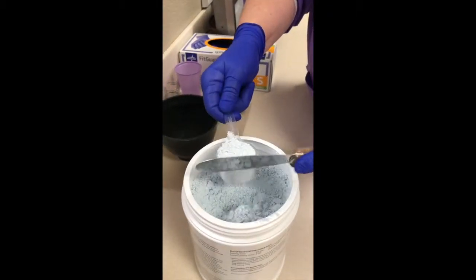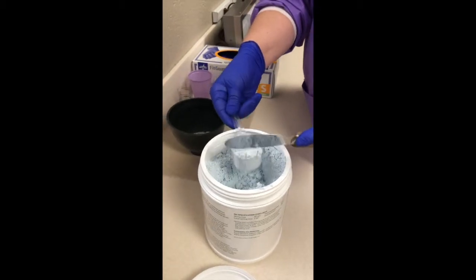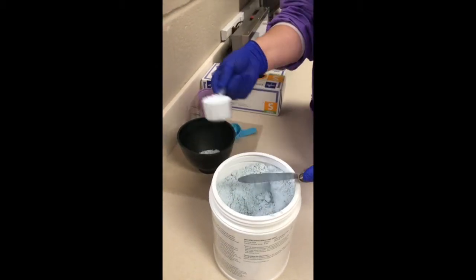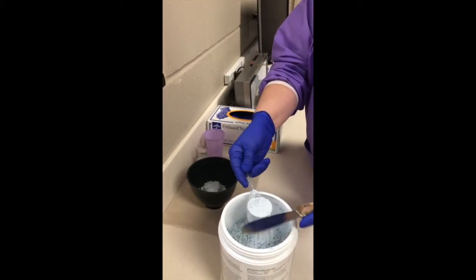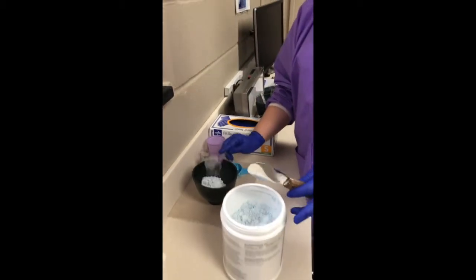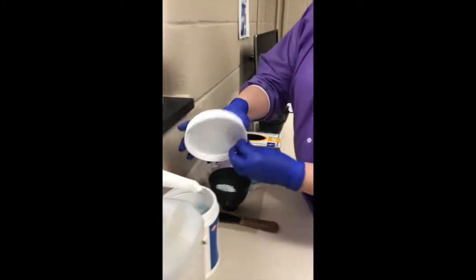Kind of just overfill and take off any excess. How many scoops does it take for a maxillary tray? 3. And how many units of water would you use with that? 3. Exactly right. And if we were going to do a mandibular tray? 2. Okay, 2 and 2.